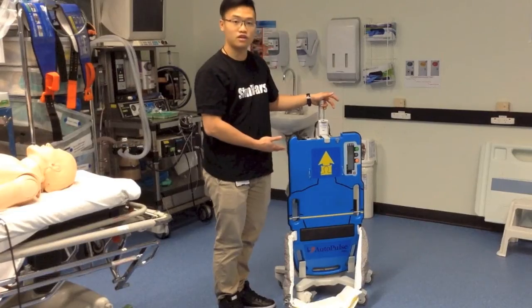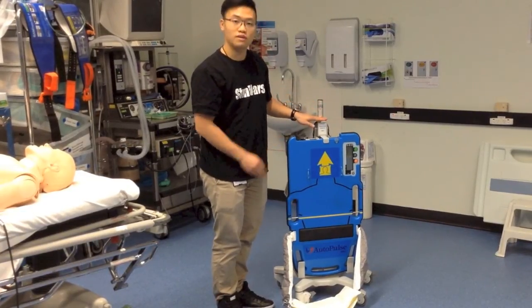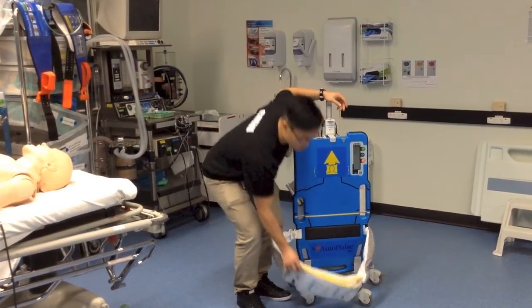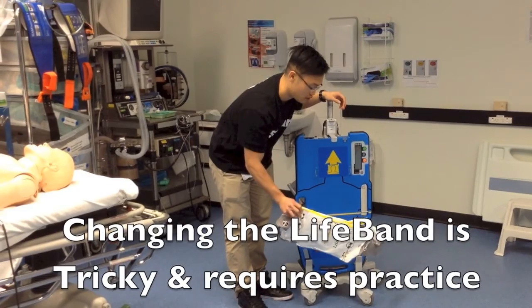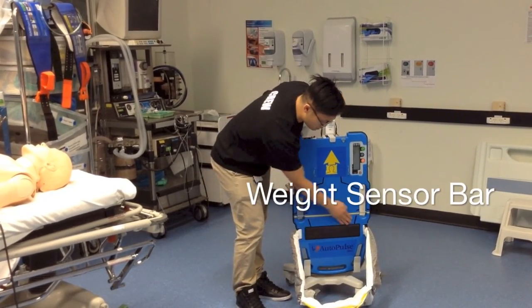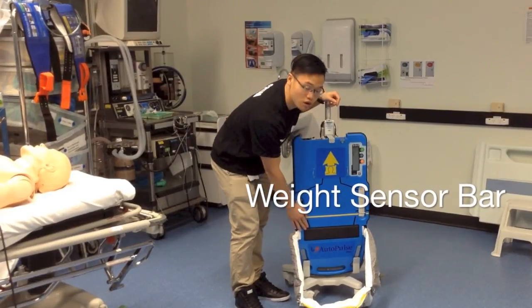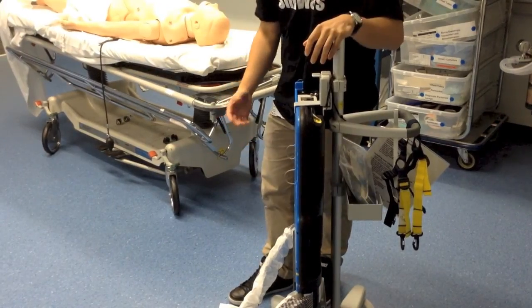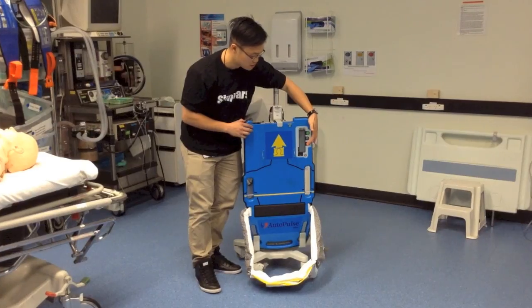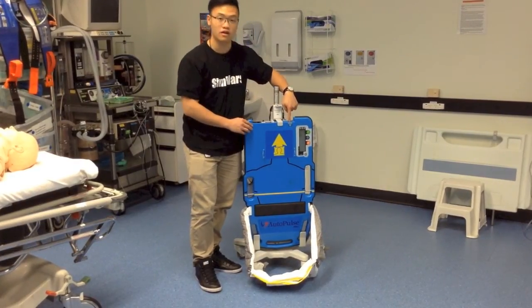This is the autopulse CPR machine. It'll be on this trolley — it's movable. It has a weight sensor bar that will sense the patient's weight so we can calibrate it. Over here we have the control pads and the power button on top.